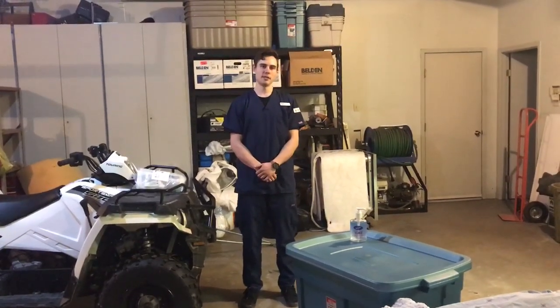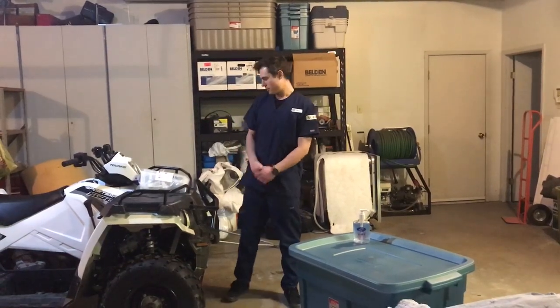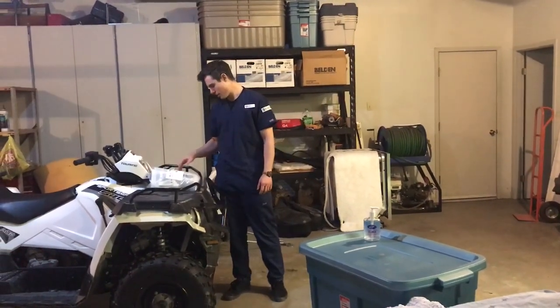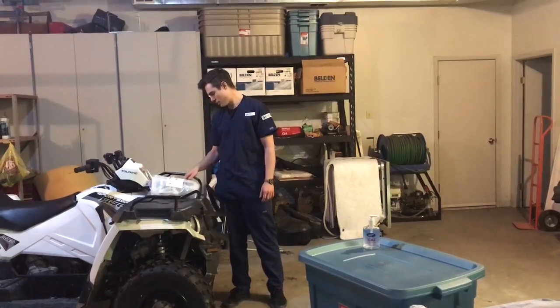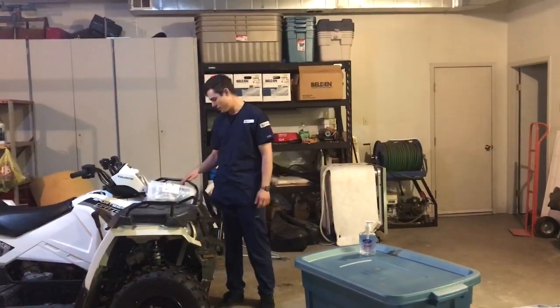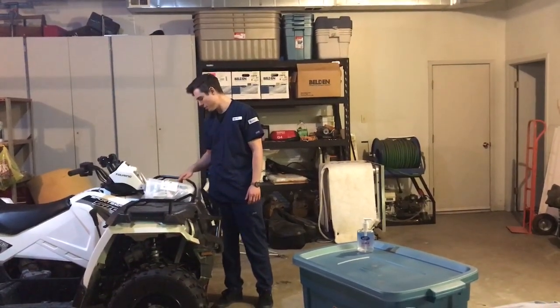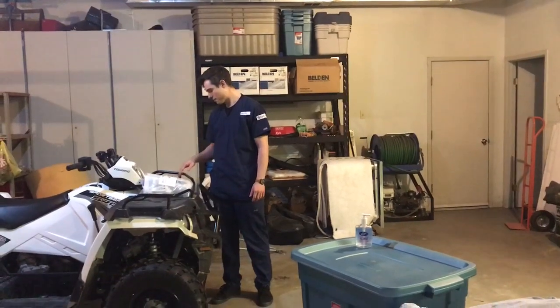Lesiuk, and I'm going to be demoing Foley catheter insertion today. Before we get started, I'm going to review the physician's orders. For February 7th, 2021, it is 07:36, and the doctor has ordered to insert the Foley catheter now to monitor fluid balance closely, monitor ins and outs.